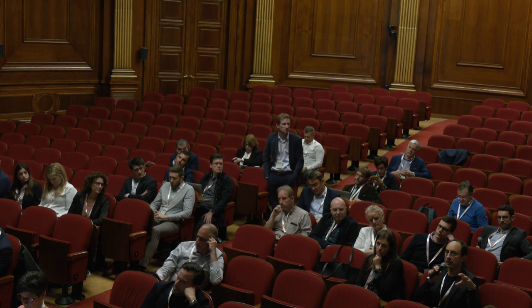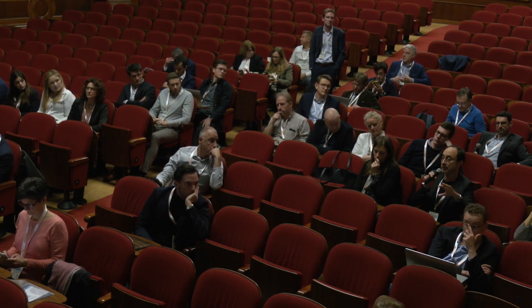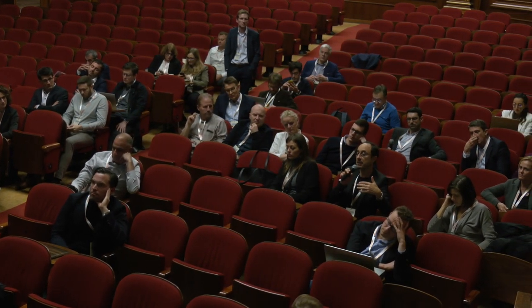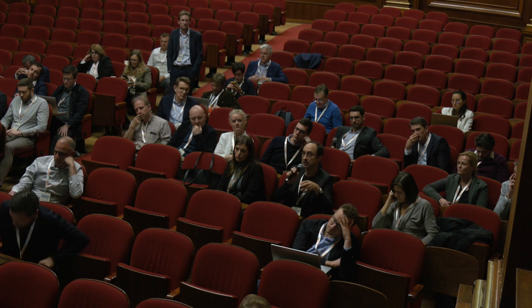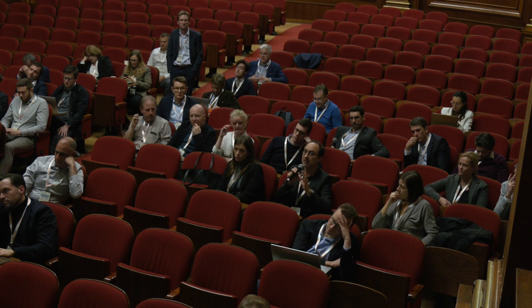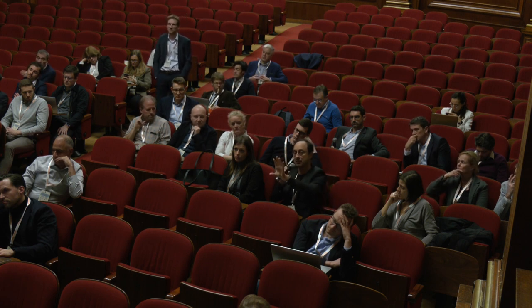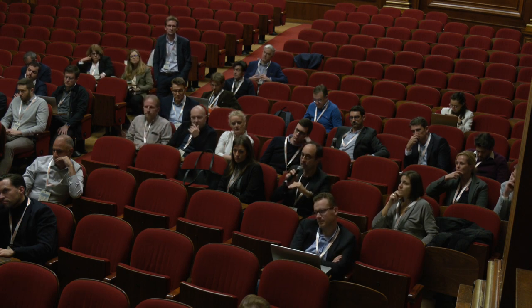I just wanted to come back a few seconds to a point that has already been commented on by my colleague just behind. I think we all had this experience: one of our major issues when we implant is the question of the axis. Sometimes the shape, the depth, the pectinate muscles and everything could be a difficulty, but maybe 50% of your difficult implantations come from the axis and the access from the fossa. I really appreciate all those anatomical and shape considerations. I think they are perfectly fundamental.